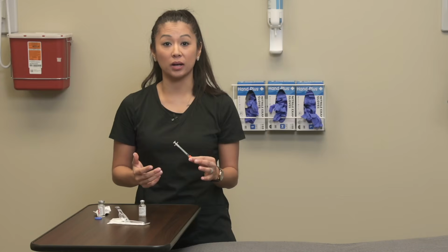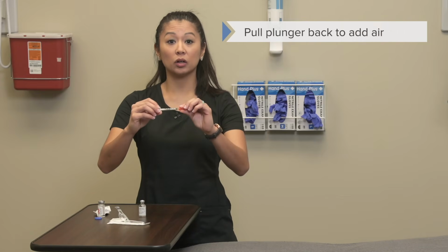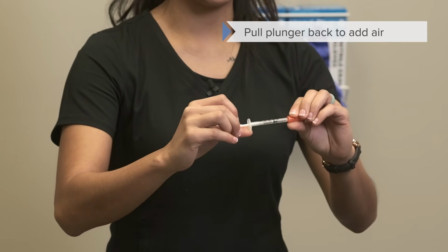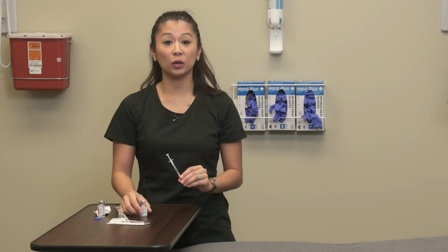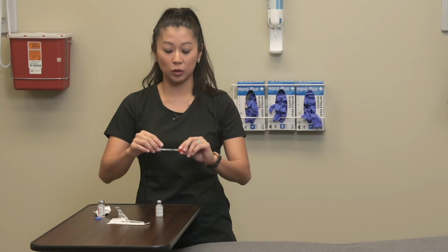Okay, so here's something to think about in regards to drawing up medication. First thing is first, we want to pull back on our plunger, and then we want to pull back air. That's right, I said air. The reason being is once I puncture the vial, I put the air in the vial. This is going to help us draw our medication up better. So I'll show you what I mean.